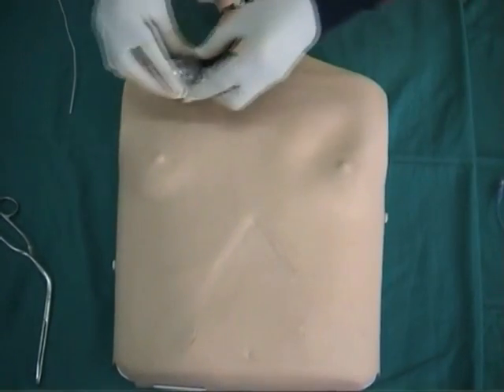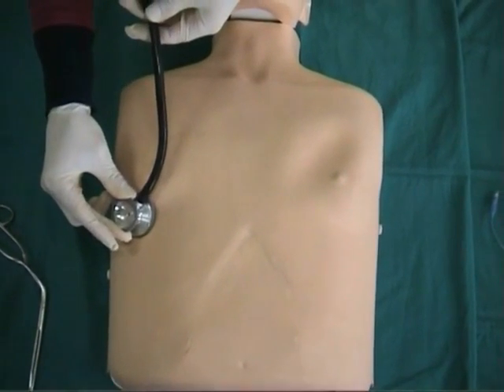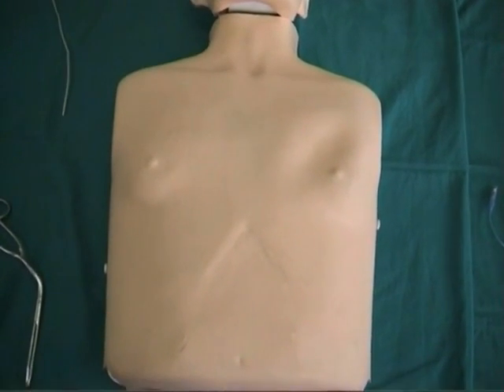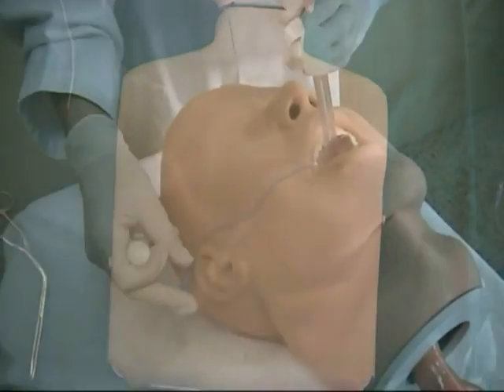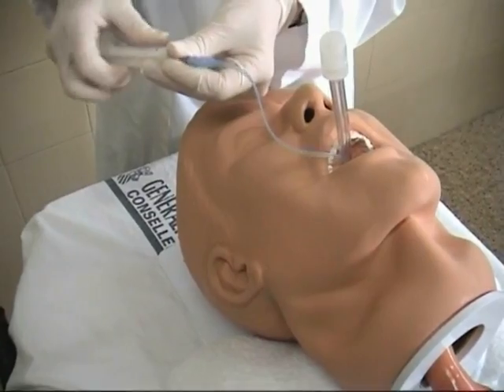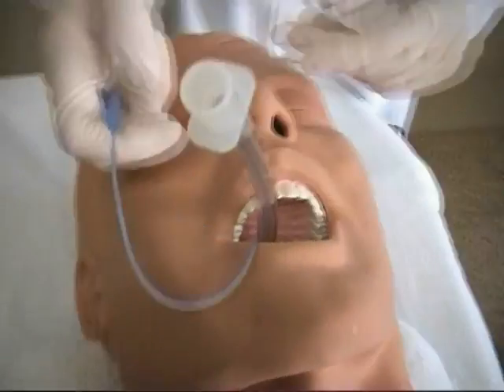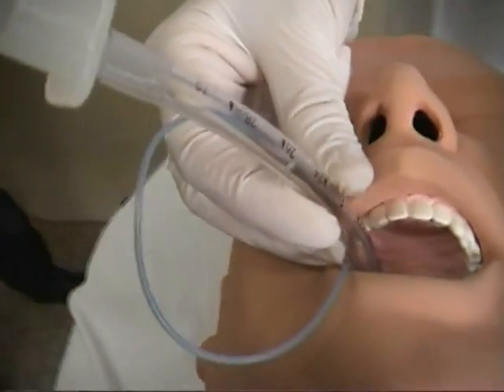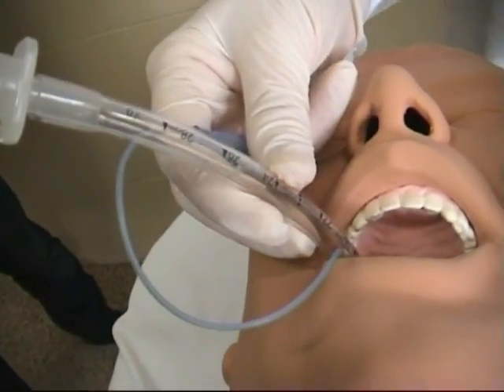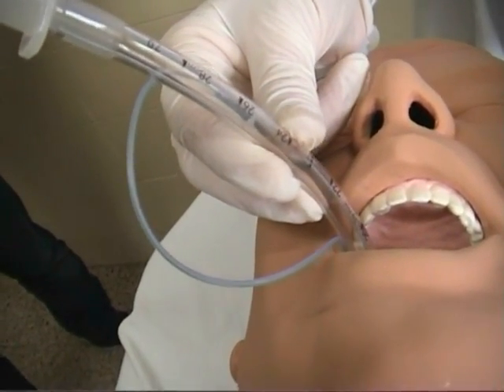If breath sounds are diminished or absent on the left side, it is suggestive of right mainstem intubation. So, we will need to deflate the balloon and gradually withdraw the endotracheal tube until symmetrical sounds are auscultated.